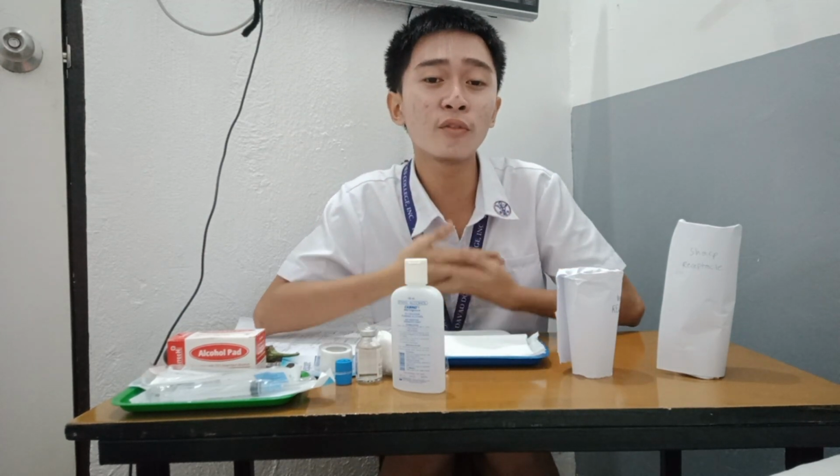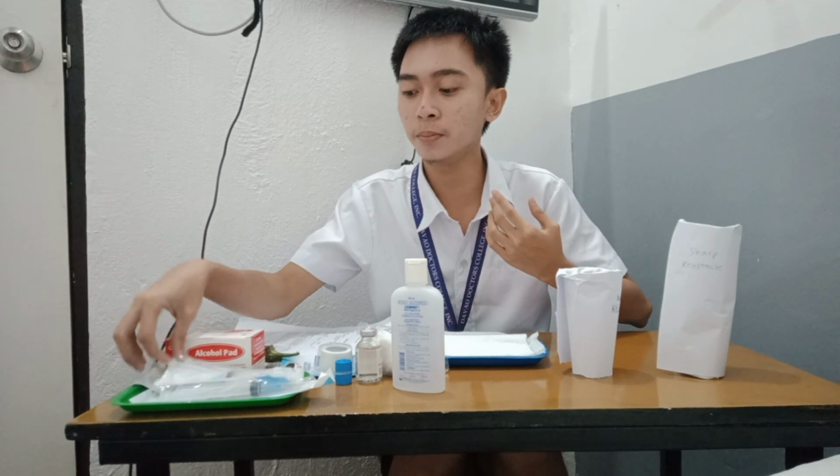And prepare the medication vial for drug withdrawal. If the medication still needs to be reconstituted, then the vial would contain the powdered form of the medication and diluent must be added into the vial. After adding the diluent, we must mix it thoroughly by rotating or rubbing the vial between the palms of our hands. After doing that, I am going to prepare the syringe. So I am going to open the pocket.